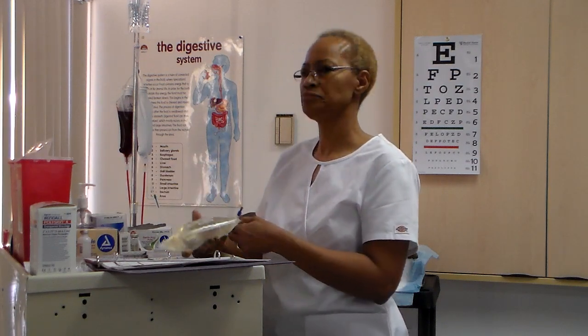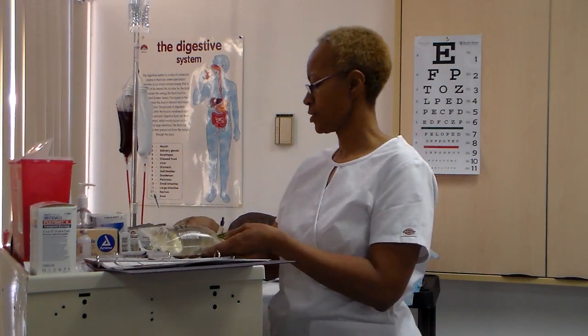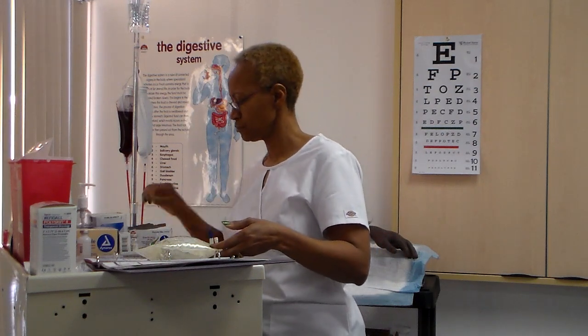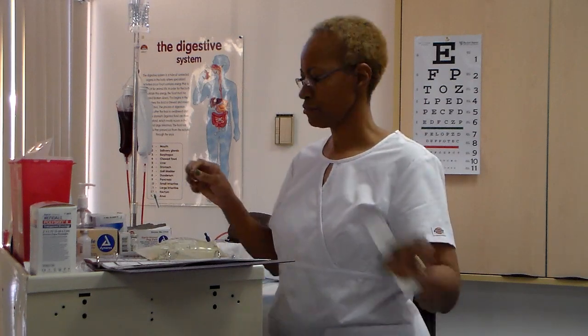Mix medication and IV solution by holding bag or bottle and turning it gently end to end. Not shaking, just tilt it back and forth. Complete medication label with client's name and dose of medication, date, time, and nurse's initials. Apply it to bottle or bag.